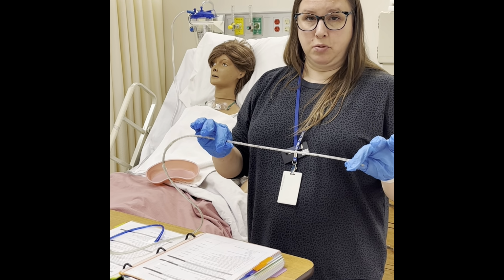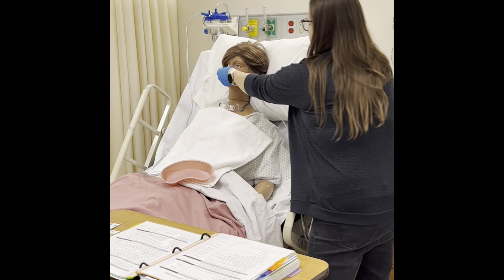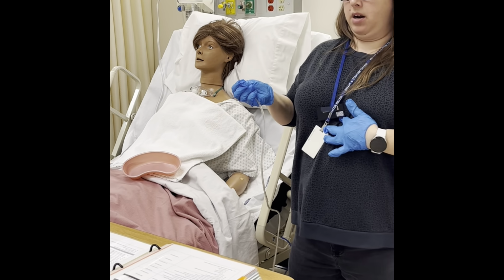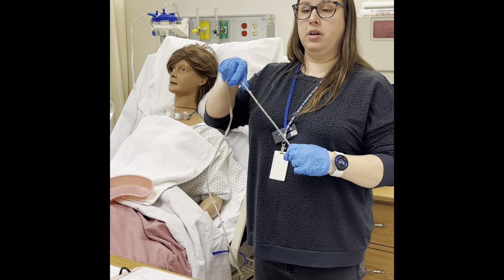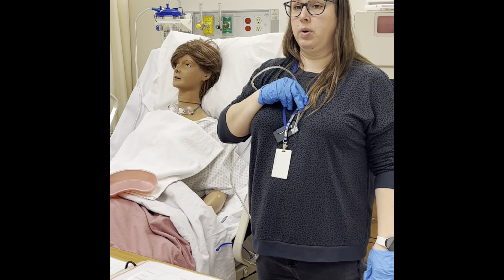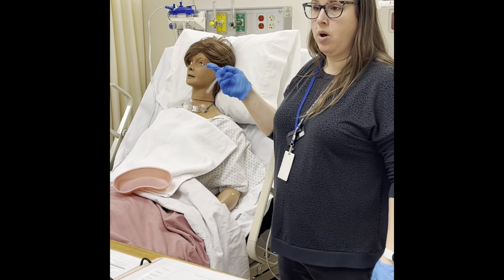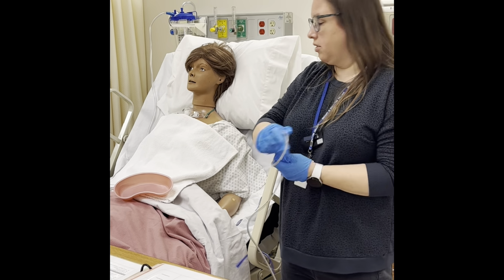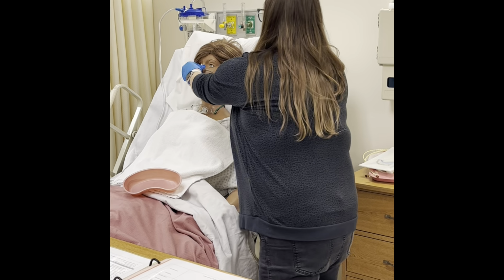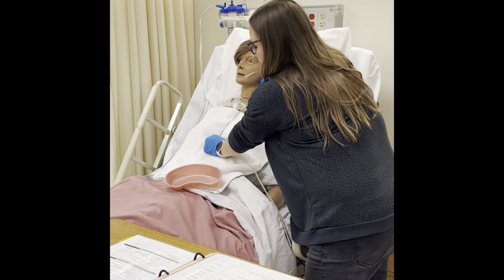So measurements. What we're gonna do is measure the tube. Tip of the nose to the earlobe, down to the xiphoid process or the bottom of the sternum. Okay, so I measure it. Is this where my stomach is? Is my stomach right here? No, so in real life we'll go a couple inches, so it's in the stomach. On her though, you can't. There's a fake stomach in here and it's like this big. So just nose, earlobe, and right at the bottom of the sternum.